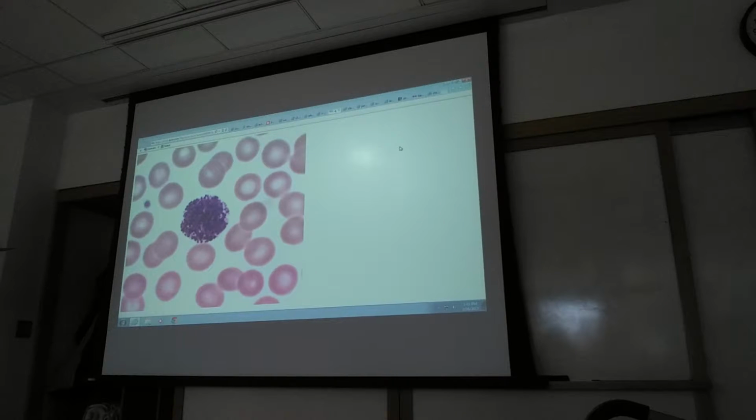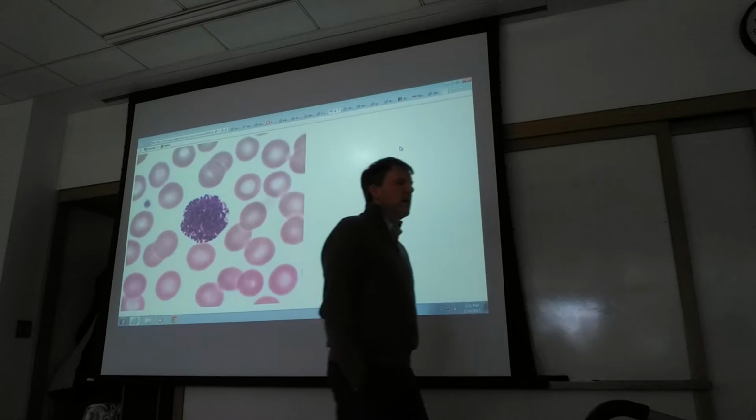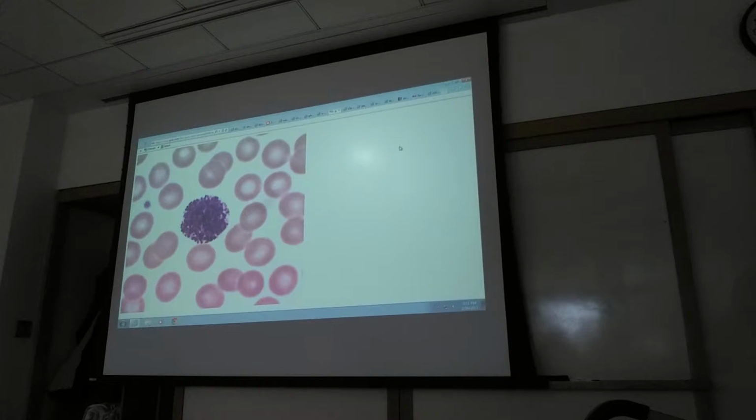This guy, again, is rare. Search around if you want, but you're going to really have to look hard. There have been terms that have gone by where no one's found a basophil, including me. So, go nuts. Extra credit, immediate A. Just kidding, no immediate A.